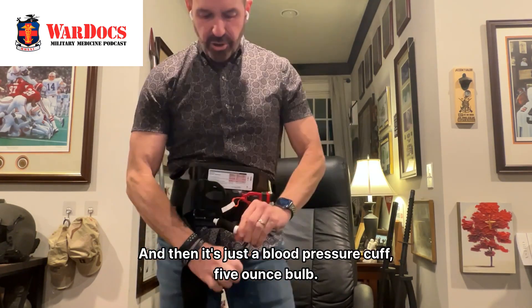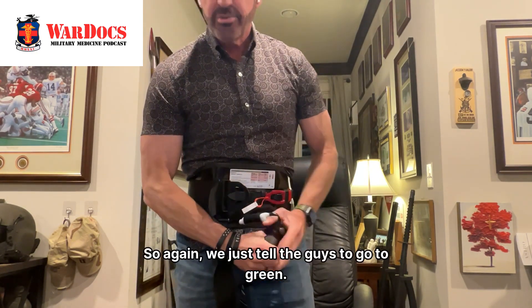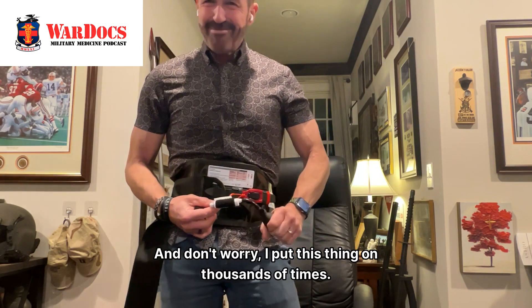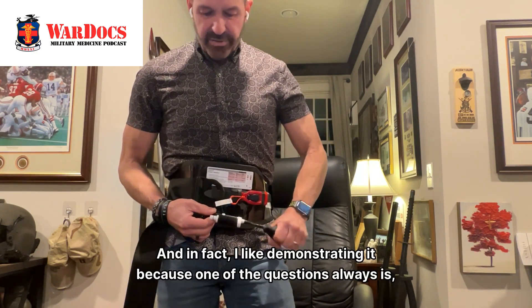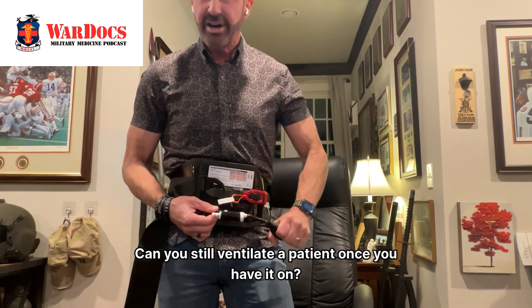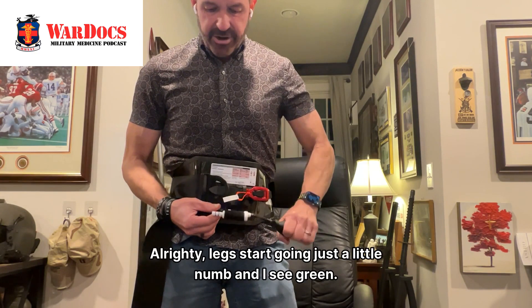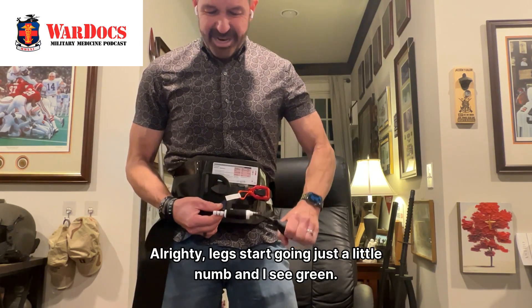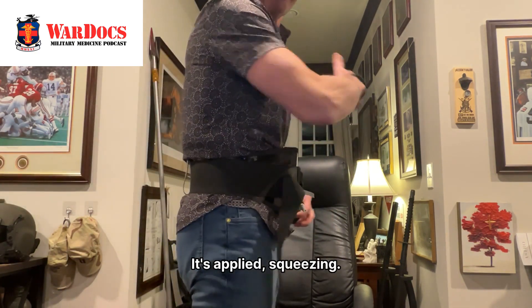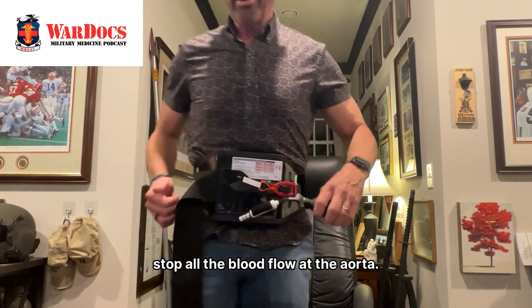It's just a blood pressure cuff, five-ounce bulb, with a gauge that has a green marker and a red marker — we just tell the guys to go to green. I've put this thing on thousands of times and like demonstrating it, because one question is always whether it impedes the diaphragm or if you can still ventilate a patient once it's on. I can still talk in full sentences with it fully applied. My legs are starting to go just a little numb, and I see green — so we're at 250 millimeters of mercury pressure. It's applied and doesn't come off the body much because it's pressing into the body to stop all blood flow at the aorta.